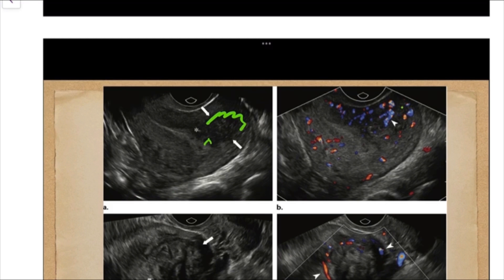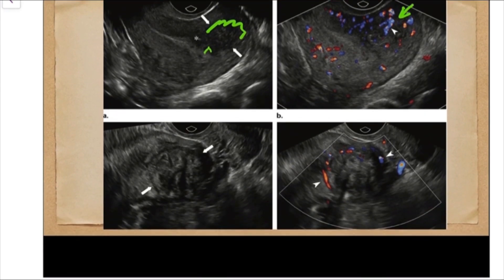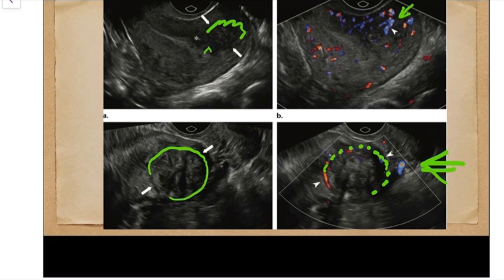Here also the endomyometrial junctional zone is very indistinct, the myometrium is heterogeneous and bulky. On color Doppler, vascularity is increased with tortuous penetrating vessels going through the lesion. In contrast, in another case we can see a well-circumscribed heterogeneous lesion. On color Doppler, it shows circumferential or peripheral vascularity — this is typical of a leiomyoma or fibroid. Fibroids have peripheral vascularity, while adenomyosis shows penetrating vessels through the lesion. That's it for today; I hope I've made this topic easy. You can ask any doubts in the comment section.